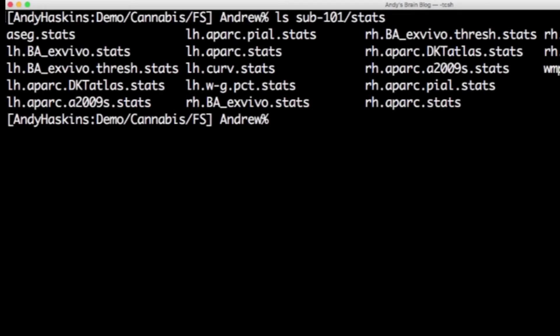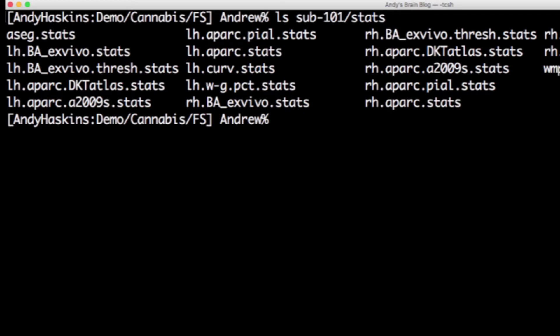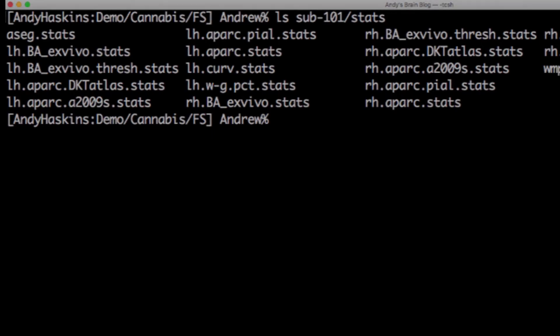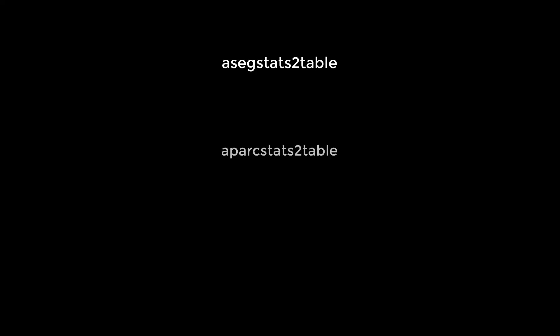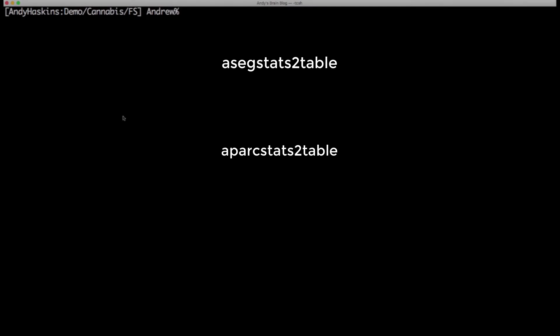For example, the Desikan-Killiany parcellation statistics for the left hemisphere are in the lh.aparc.stats file. The segmentation statistics across both hemispheres are in the aseg.stats file. To organize these data for input into a spreadsheet or statistical package, we will use the commands aseg stats to table and aparc stats to table.